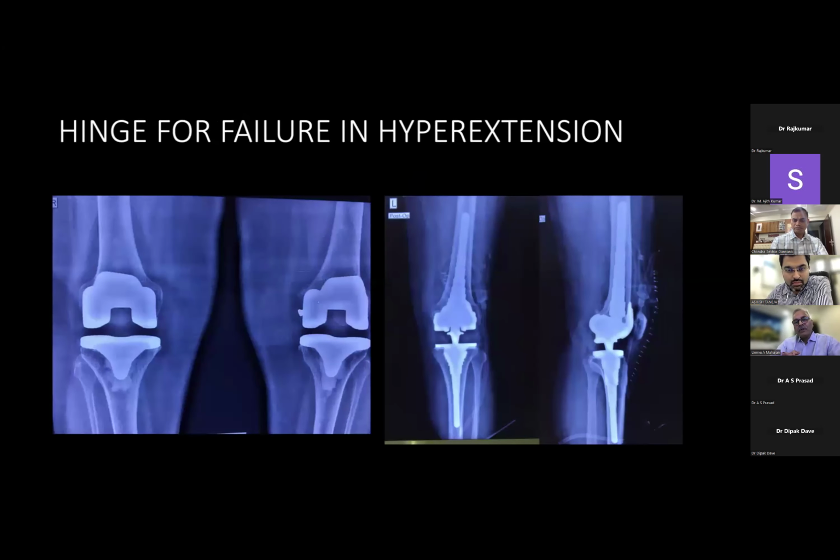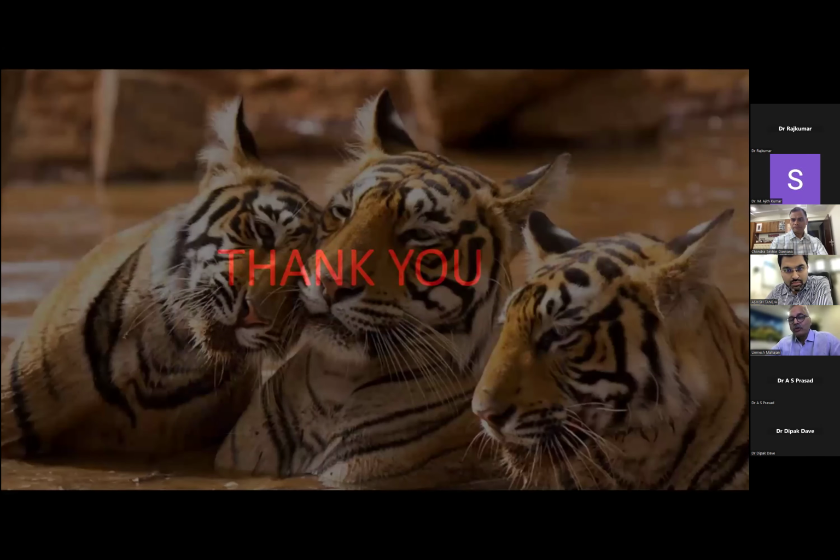Of course, hinge. I had this patient who had an exchange, completely failed in hyperextension. He was going 30 degrees hyperextension. We tried initially with a constrained device and then ended up putting a hinge for him. When you're in hyperextension or anything like that, you have to have a hinge, or when you have an MCL deficiency. Thank you so much.